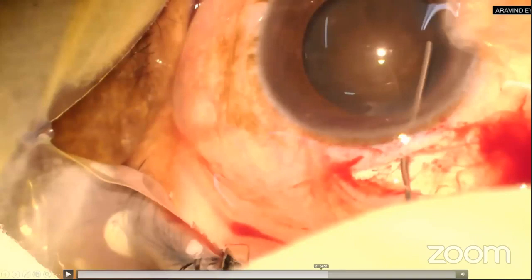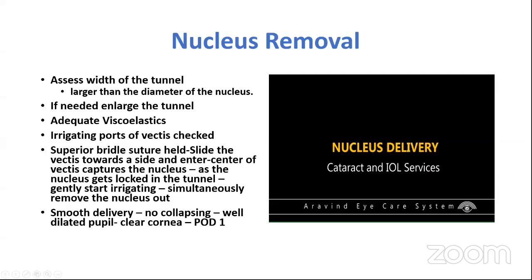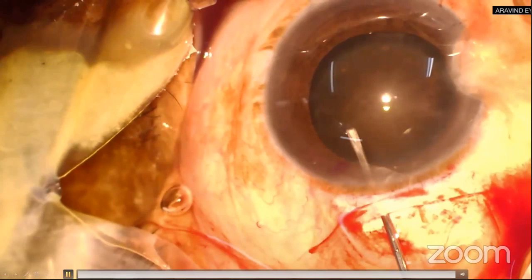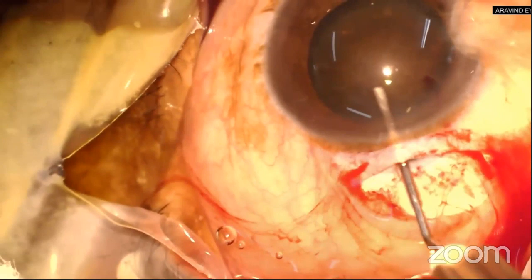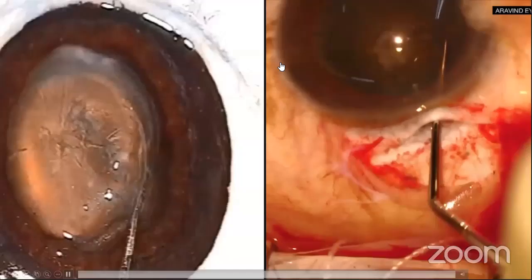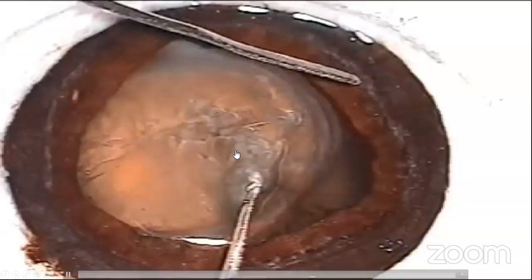But in case you have a... Here again, you can see I am performing a rhexis in a nucleus that's showing a little bit of phacodonesis. I hope the phacodonesis is visible. The rhexis is complete, and I'm doing a gentle hydrodissection. And the nucleus prolapses through one pole, which indicates my rhexis is larger over that side and smaller over the other half. So I should normally have gone and prolapsed the nucleus through the left-hand side. But instead, when I tried to prolapse through the right-hand side where the rhexis is small, you can see it can cause a zonular dialysis if I proceeded with it.